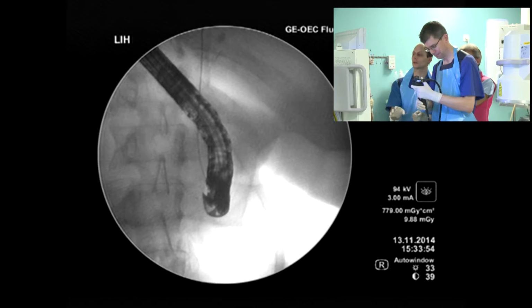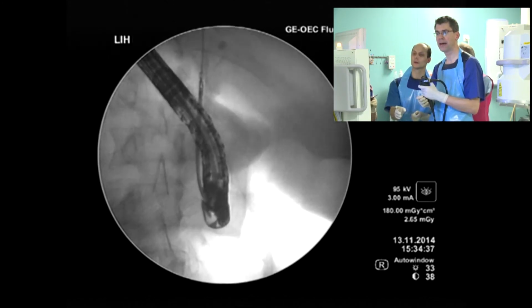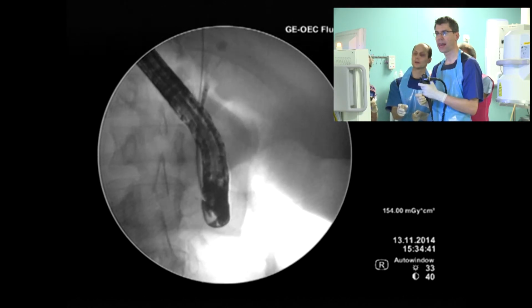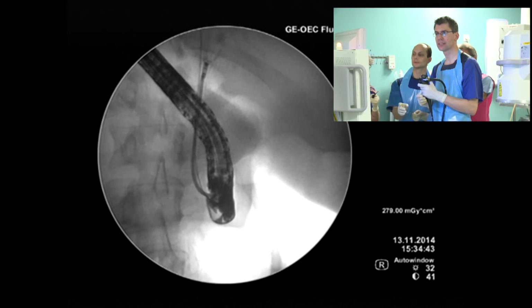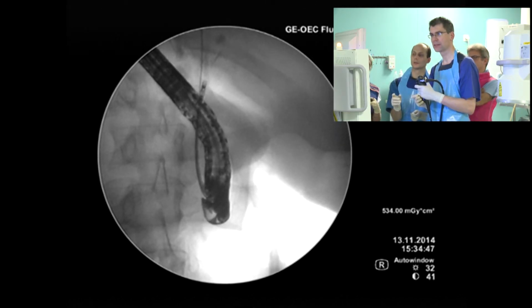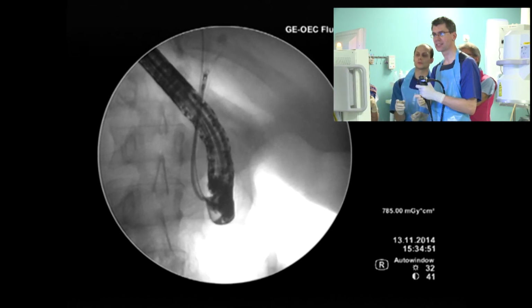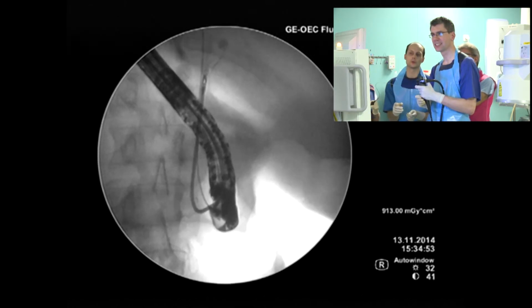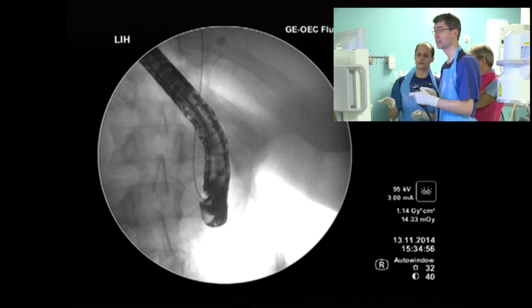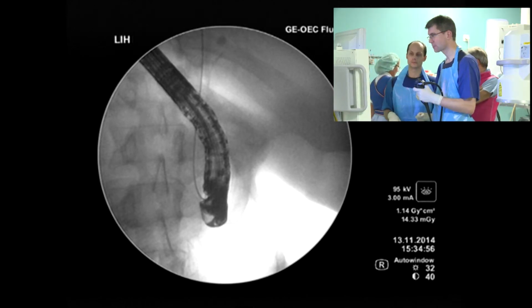Could you tell me, please, what kind of picture you see? Now we can see you and we can see X-rays. We don't see endoscopy, but I think we don't need it. Yes, right. Through the papilla, we move instruments. And the endoscopy picture was quite nice during the first procedure. Technically, it's all the same.